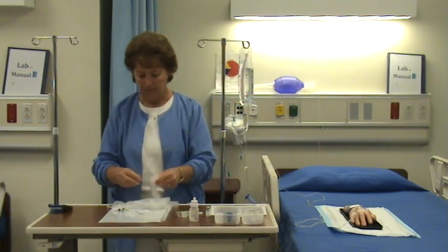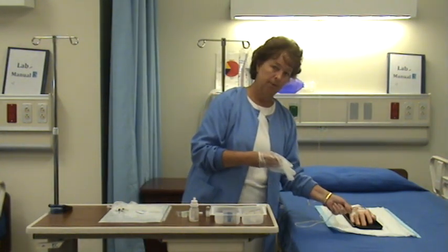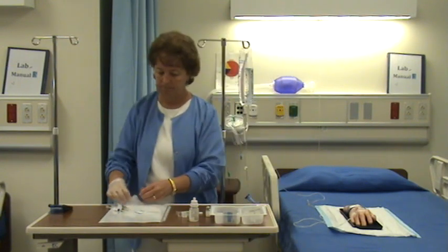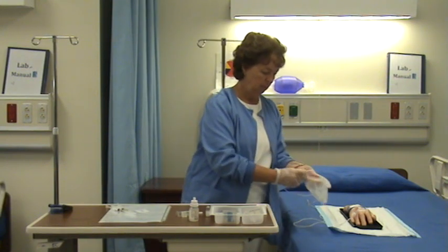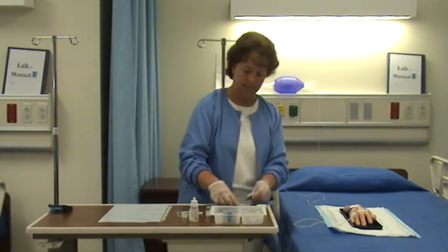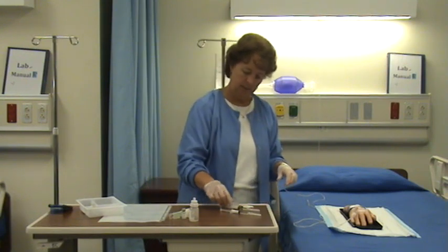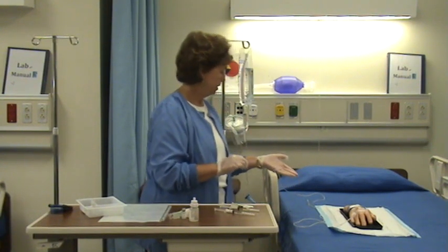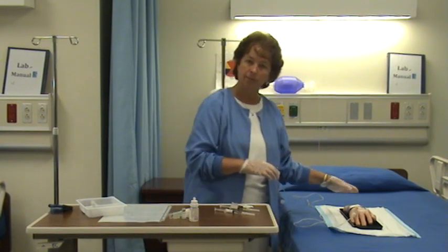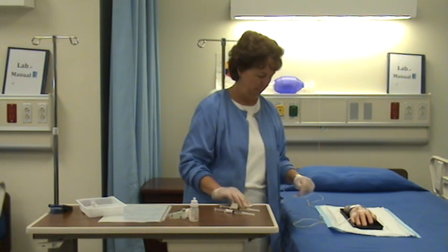I'm going to place on my clean gloves because I'm right here at the site. So if I'm giving them medication, the patient pulls away, it could be exposed to blood if the IV came out. So I've got clean gloves, got my Lasix, and I've got my flush. I assess the site and I see that it's running well. There's no sign of infiltration or phlebitis. There's no redness at the site.